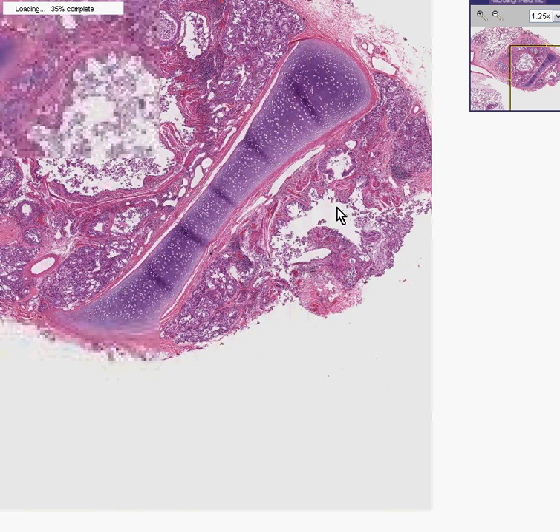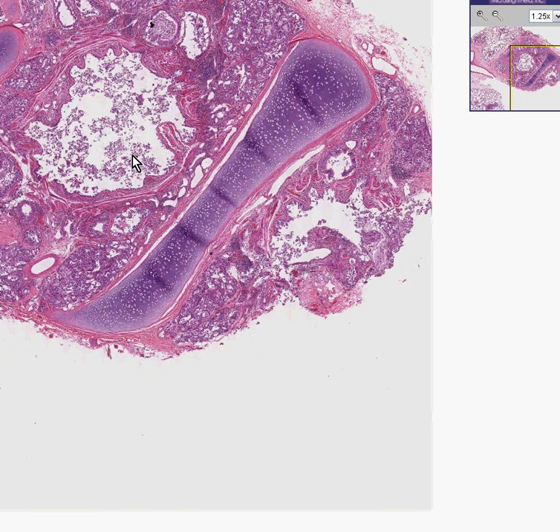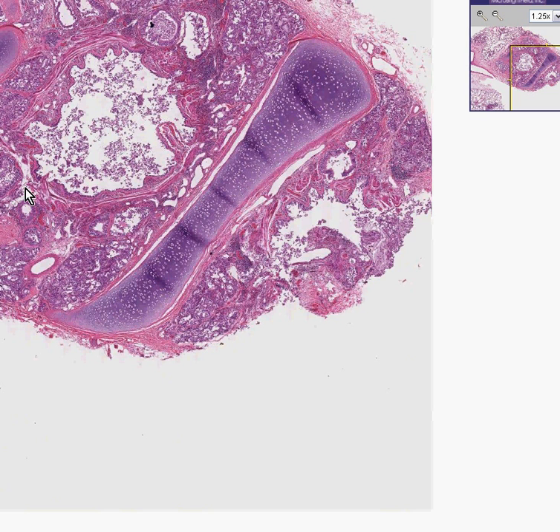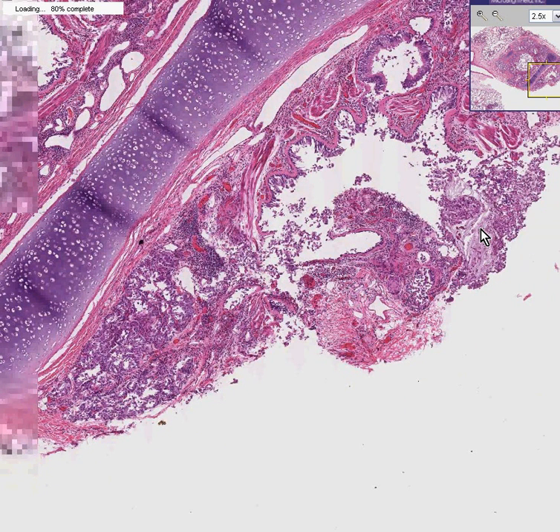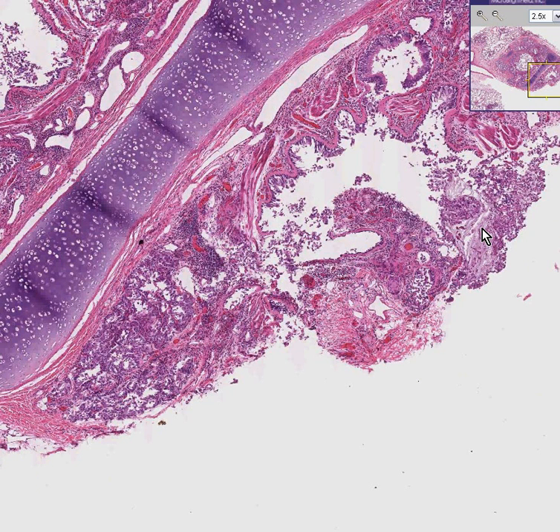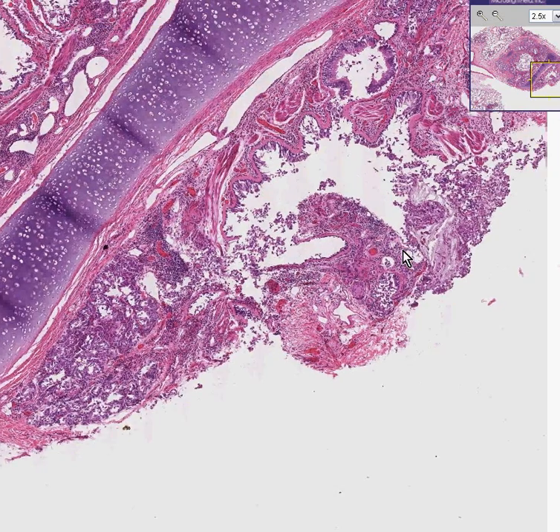Once again, in the small bronchi and bronchioles, you can already see that there is smooth muscle hypertrophy. You can see that there is increased mucinous material within these glands, so-called mucus plugs, because of hypersecretion of these bronchial mucosal glands, as well as increased numbers of goblet cells. In addition, there's a significant amount of chronic inflammation surrounding this. Because of the presence of increased mucin within these areas and these mucin plugs, the airways distal to this are over-expanded, resulting in over-expanded alveoli.